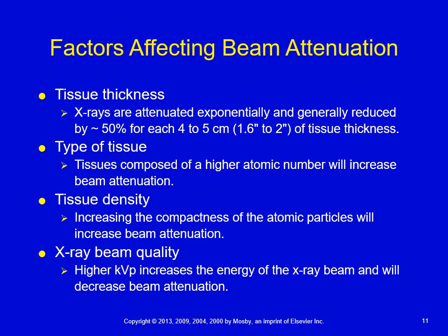The next factor is the type of tissue. Different tissues are going to absorb the X-ray beam differently. The tissues that you'll typically X-ray are going to be bone, soft tissue, muscle, fat, and air-filled organs. Of those tissue types, bone, because it has a higher atomic number, will absorb more of the X-ray photons than an air-filled organ. Vice versa, bone will transmit fewer X-ray photons through to our image receptor than air-filled organs.